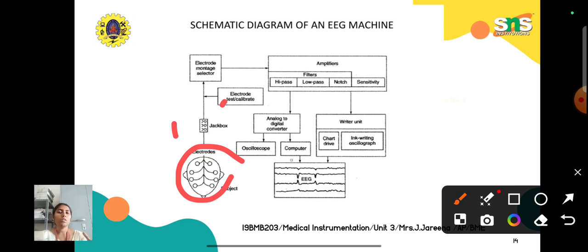As I said, if you are using a medical device for a prolonged time, there is a chance for that medical device to get affected. The accuracy of the medical device will also get affected. In place of giving the value 10, it may give some other value like 9 or 5 or 6. So each point of value is very important for the treatment of people.